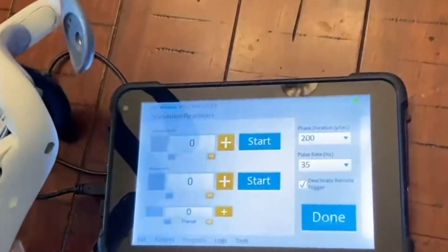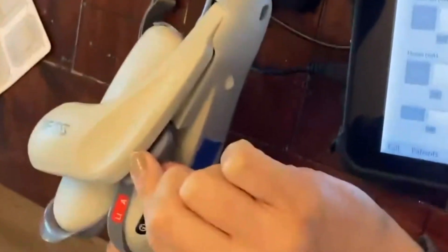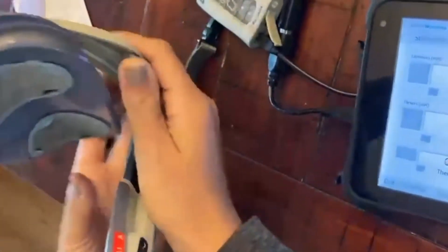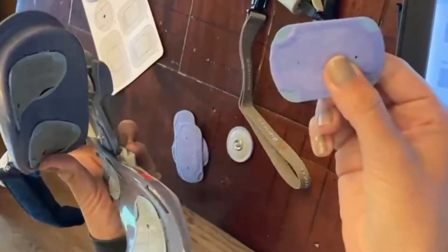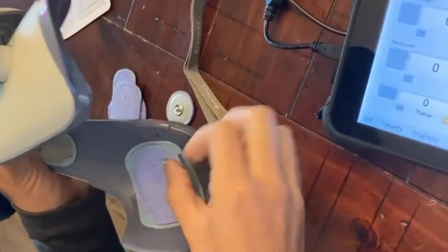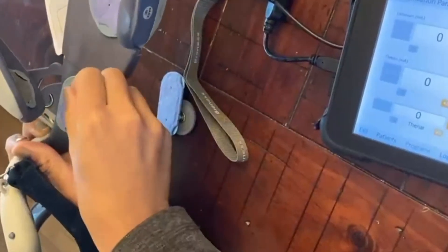Next, you'll want to place the electrodes on the orthosis. Lift up the extensor wing by squeezing and lifting, and place the matching electrode into the panel.